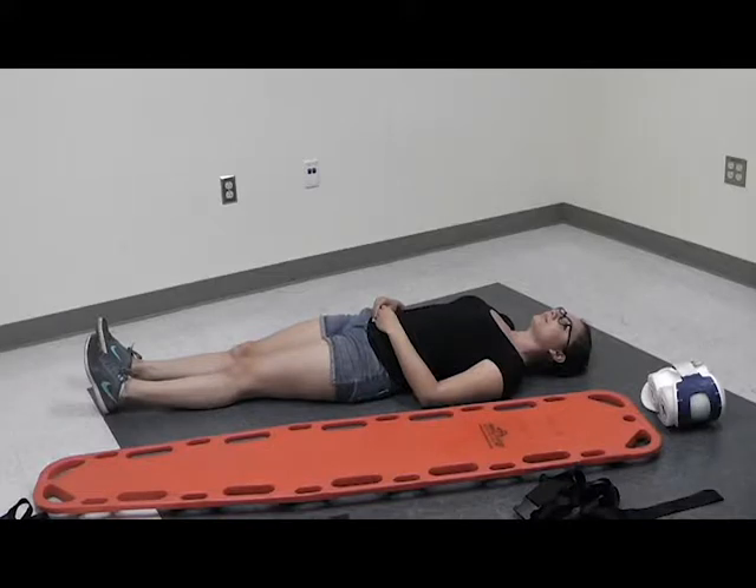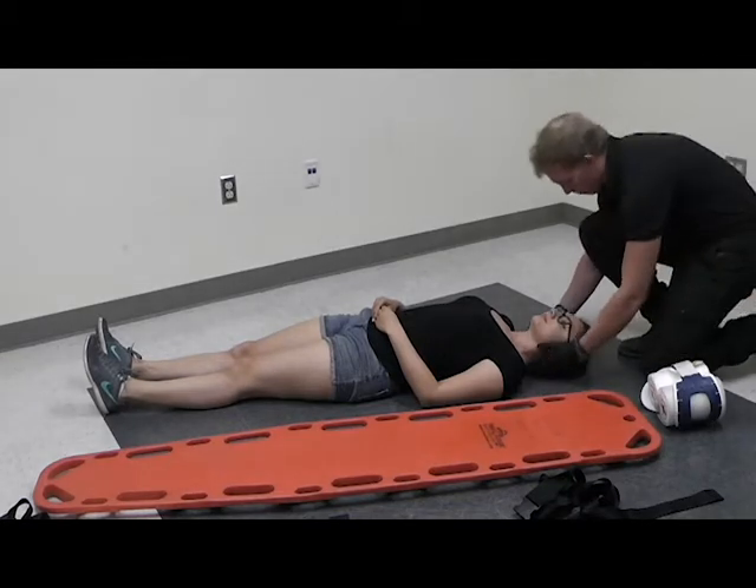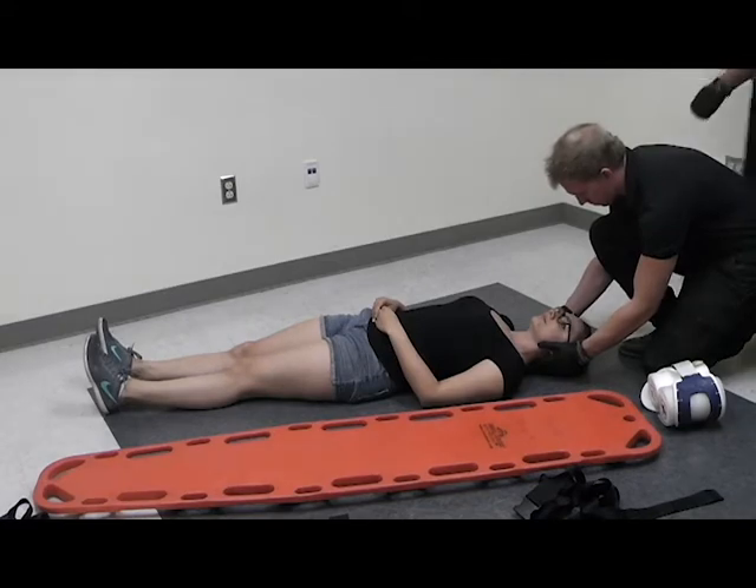This is a demonstration of long spine board, or cervical board, application. I'm first going to start with my scene safety and BSI precautions. At this point, I'm going to direct my partner to start manual stabilization of the head in a neutral inline position.